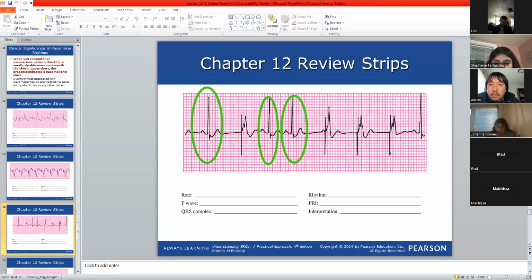Yes. Very good. So this yes, this yes, and this yes, we put what word? Normal, normal, normal means sinus. Very good, this is what I need. So these 3 beats represent sinus activity. You agree? Yes. Very good.